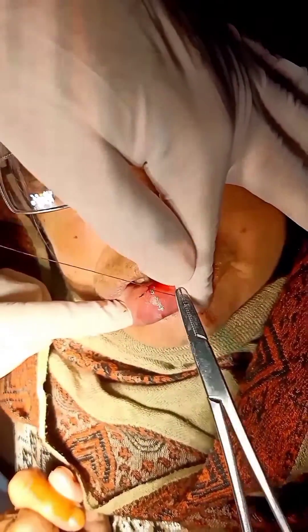So finally we will proceed with this case. We are tying the suture behind the swelling. In the zoom-out view, you can see that we are tying the suture and the bleeding is secured.